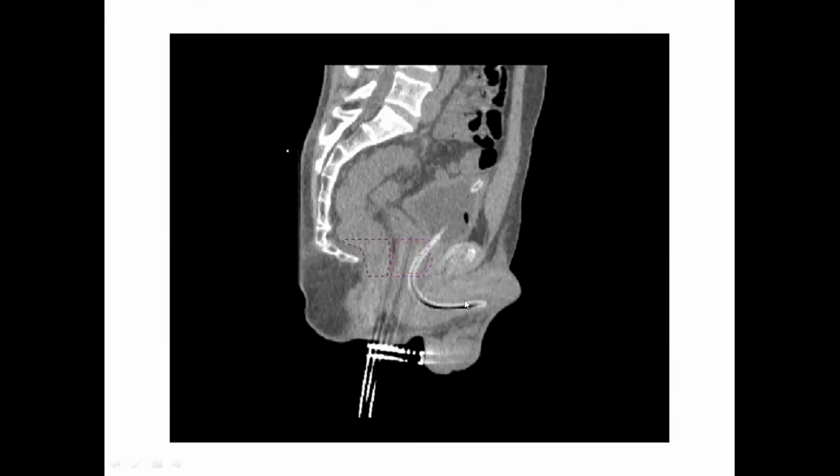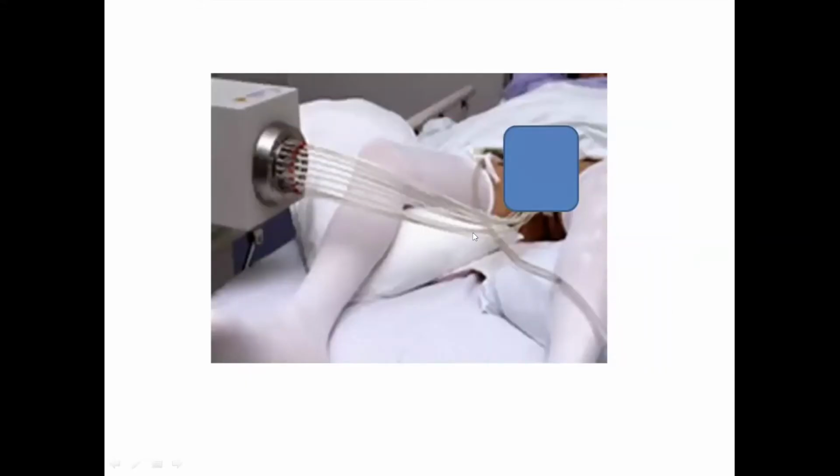You can also see quite nicely on this image the catheter, or at least some of it. So the catheter does this U-bend here, where it's coming in from the penis. It's going through the urethra, round up through the prostate and into the bladder. And then it's protected with a little blob over the relevant region here on the final image.